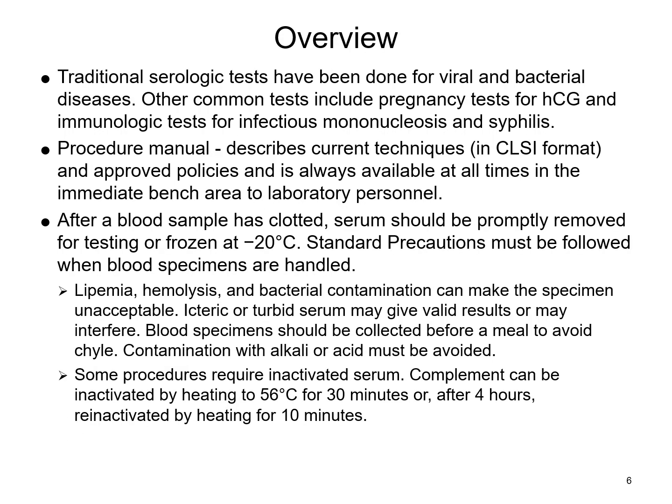Serologic testing over the years has been a very important part of the diagnostic testing done in the clinical laboratory for viral and bacterial diseases. Immunological testing is done in many areas of the lab, including microbiology, immunology, hematology, immunohematology, which is blood bank, as well as many other areas. We actually use a variety of specimens when doing this testing as well.